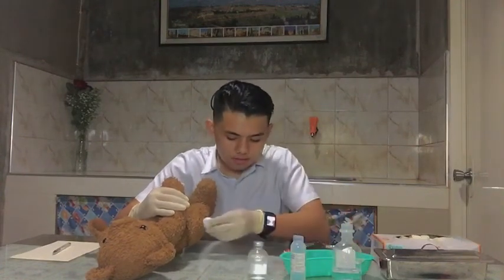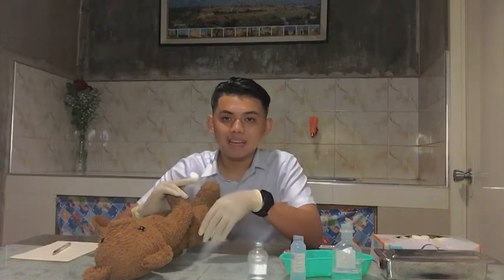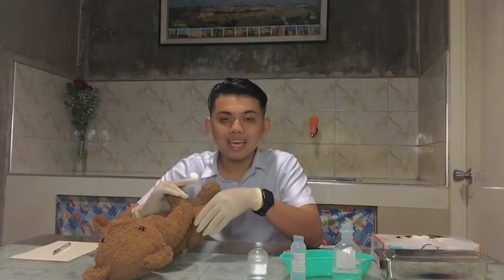Wet. Dry. Now, transfer and hold the swab between the third and fourth fingers of your non-dominant hand in readiness for needle withdrawal, or position the swab on the client's skin above the intended site, again to prevent needle prick injury, and seeing the needle through the skin serves as a guide to the depth of insertion.